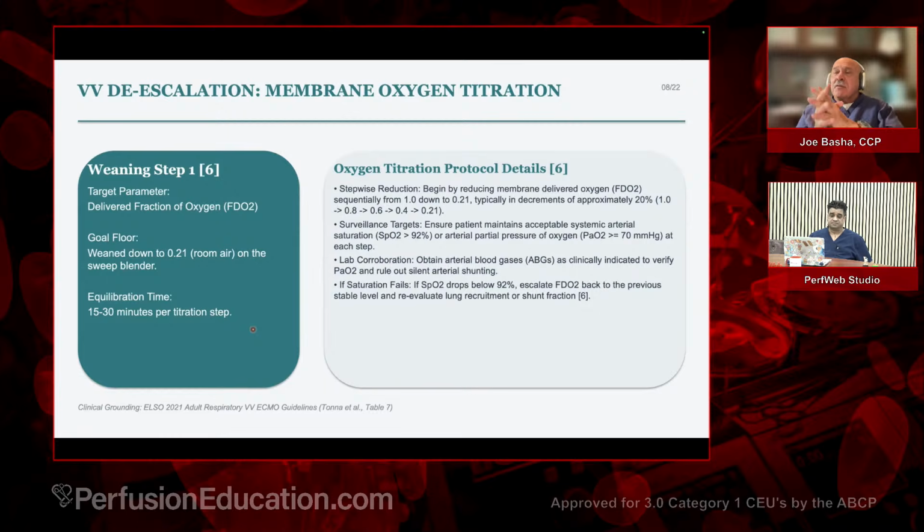I do too. But it's also important that you're measuring the PaO2. And yeah, you can use an SpO2. I don't have any problem with that if it's accurate. It works. And just keep your saturation above whatever floor you've set. The standard is 92% saturation, PaO2 about 70. So that's your standard. But you may feel different. You may say 80. Your intensivist may say 80. I'm happy with 89%. That's where this patient's going to be, and I'm happy with that. So you really don't have to come down.